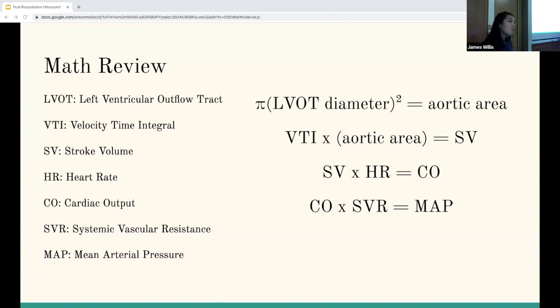I just actually had a logistical question. In your case, after the second 500 cc where you got the 12% change, are you doing the VTI from 0.1 or 0.2 compared to that 0.3? Sorry, so from the immediately previous one. So it's previous to previous, not initial to most current. You only look at your delta. The only potential benefit from this is looking at what I did from last time. Point B, was my intervention to give some fluid, Point C, oh, that's what it is. Point B to say what I just did had merit. Got it. And so, okay.